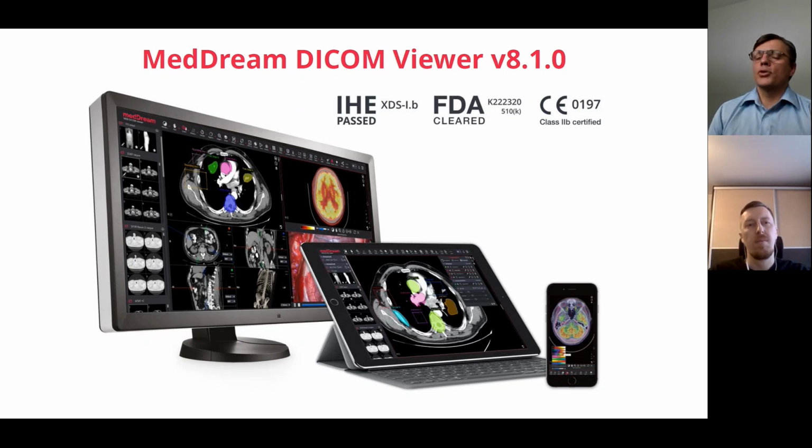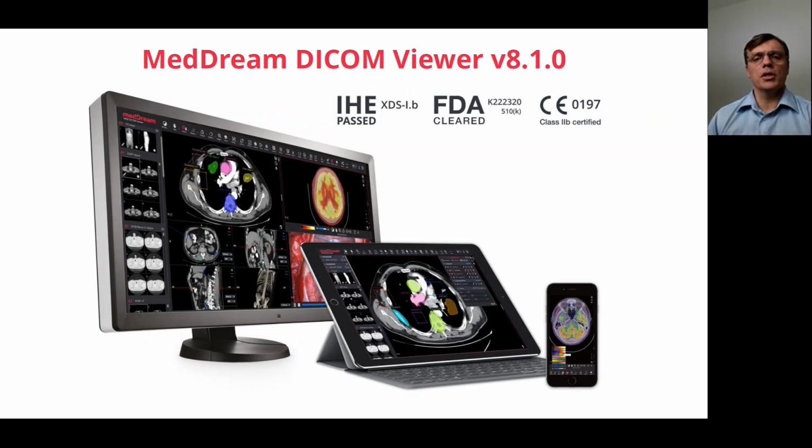So let's turn back to what's new in version 8.1. First of all, from a certification perspective, this is the first version officially cleared in the USA for mammography diagnosis, and we are very proud.